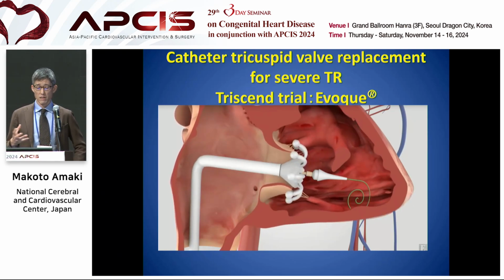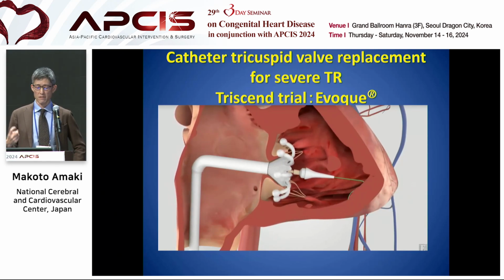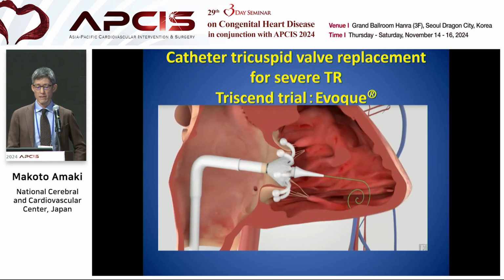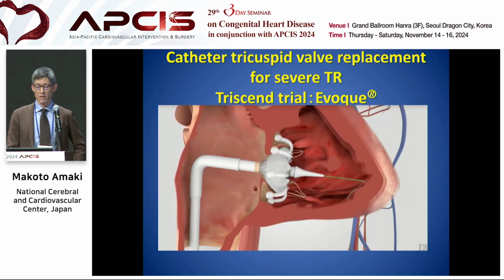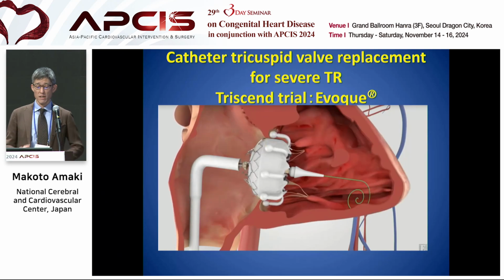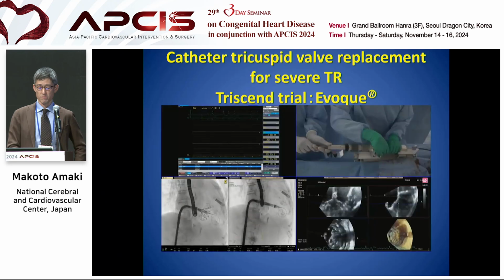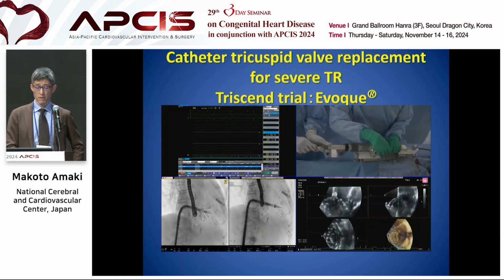The device catches the subvalvular apparatus with this anchor, and we implant the bulky valve into this valve, so that the anchor and the valve sandwich and release the anchor there. And this is the actual device therapy images. You can see it's very bulky.